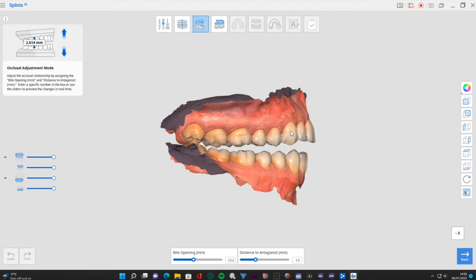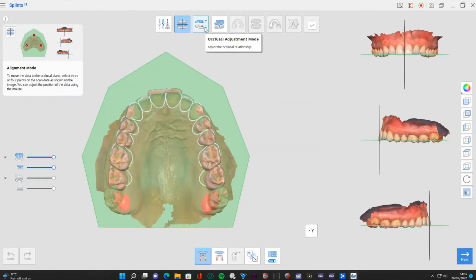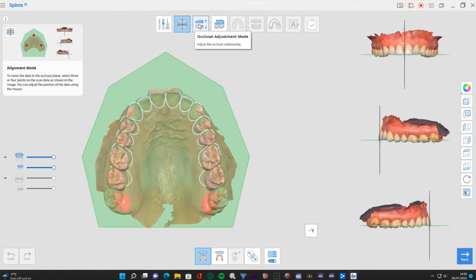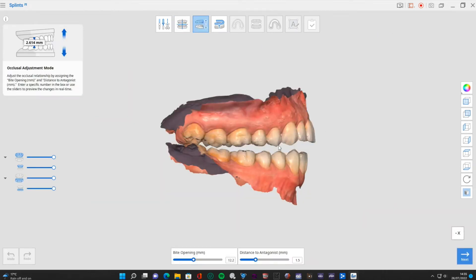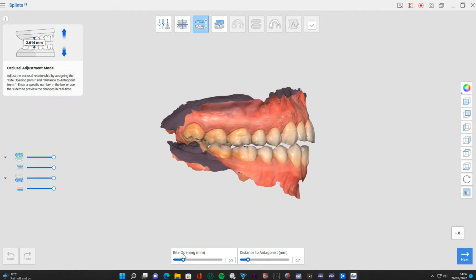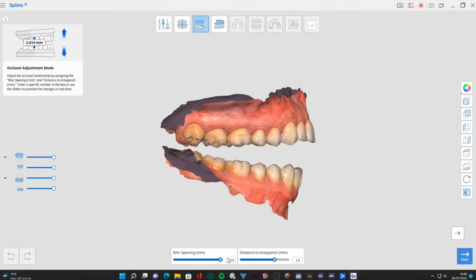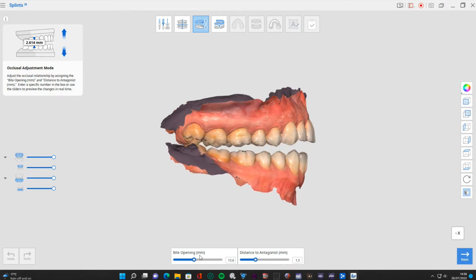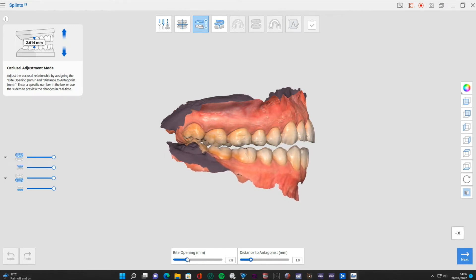One of the nice things I've noticed about this software: when we go to the next stage and it opens the bite, it doesn't just open it vertically - it actually retracts it a little bit as well. Watch it shift back as well as down. It's actually got an artificial hinge that's been brought in, and I haven't used any articulation, bite fork, face bow, or virtual articulator settings - I haven't brought in anything like Modjaw for dynamic occlusion. It's just its own interpretation of how that occlusion should be, which is nice.